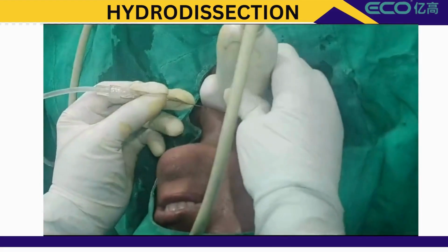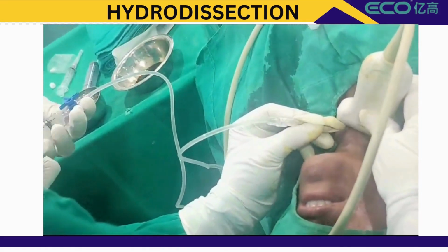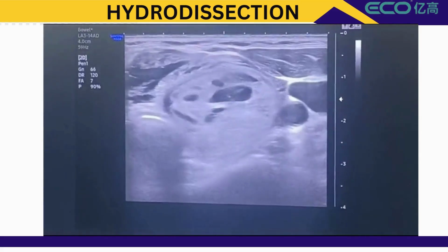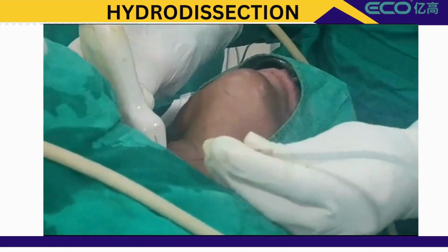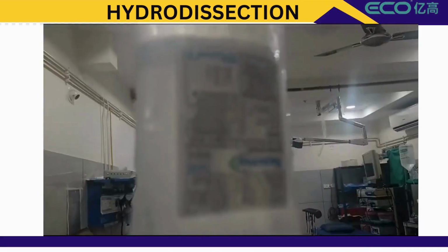Next we go for hydrodissection. What is hydrodissection? Instillation of a colloid solution, 30 to 40 ml of a colloid solution like Voluven expansion. You can use it in the medial compartment and the lateral compartment. So we do two compartments.